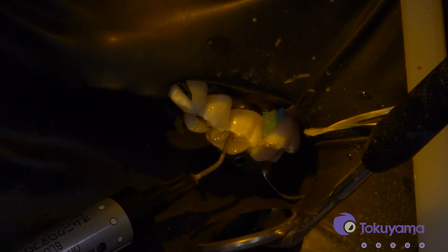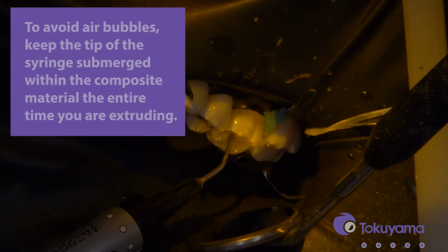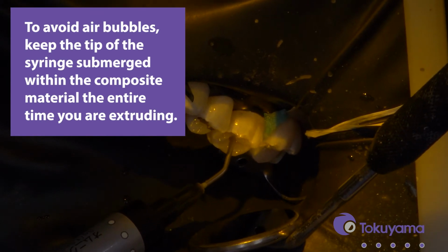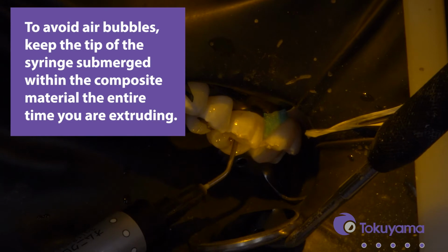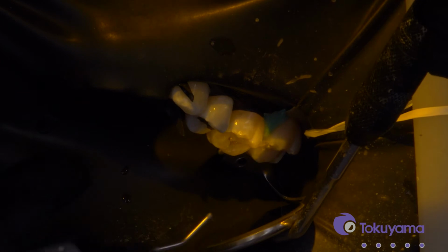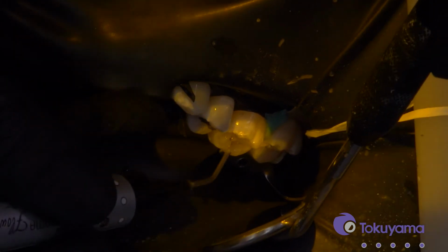When you're syringing the material onto the tooth, keep the tip of the syringe embedded in with the material. If you lift it and raise it and lower it, you'll probably incorporate some air bubbles here. So I just want to come in and make sure I cover all my discolored areas. What happens if you miss a spot? You could always come back and add a little bit more, so no worries there.